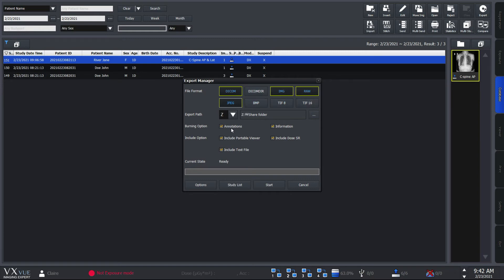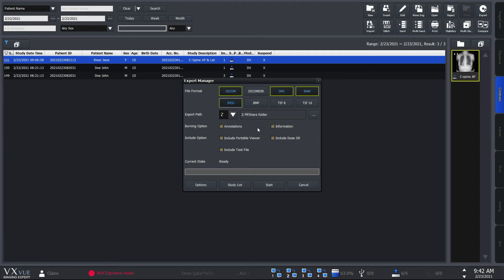You can also choose which information to include, such as the annotations and overlay information. VXView also supports you to export the studies to network drive so that you can share and work with the images more efficiently.